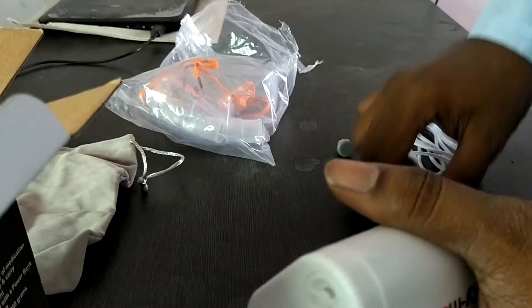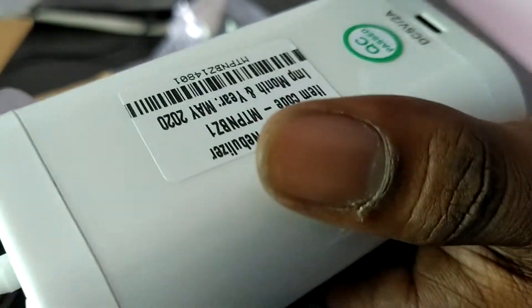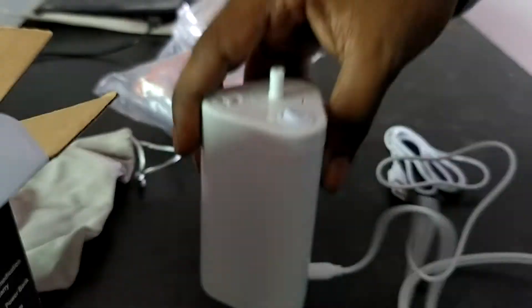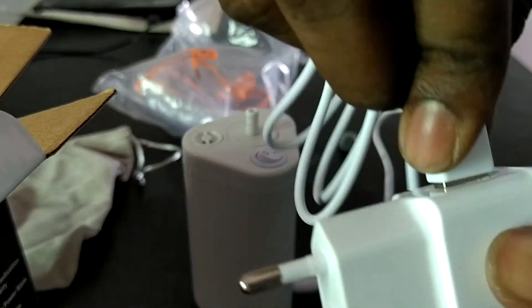Portable nebulizer machine — connect this wire to the back side of the machine here. This is going to push, then this one will be connected to the cable here.